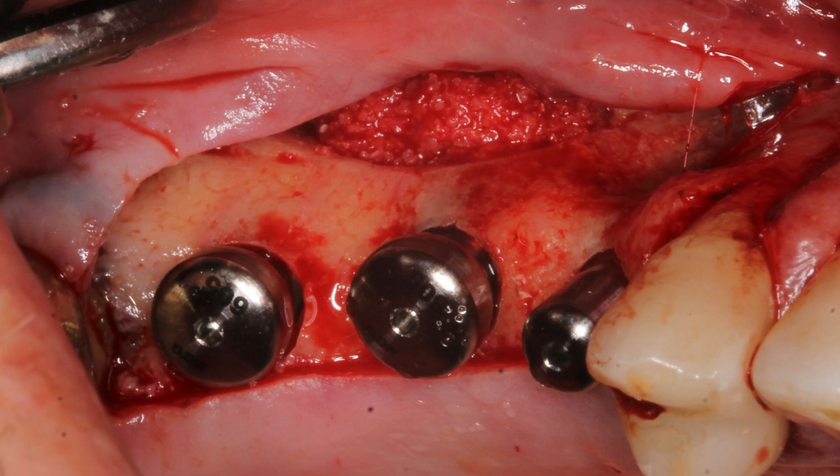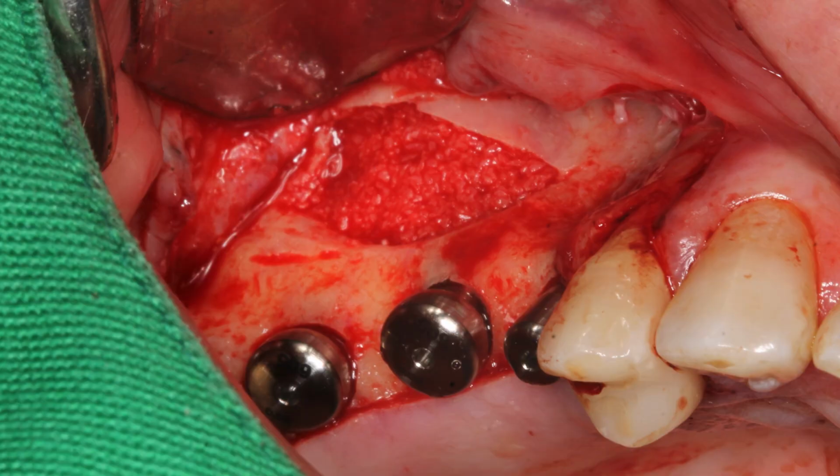The second thing is the height. You can clearly see the height of the bicuspid is much taller than the gingival margin, and the ones on the molars are slightly higher. The higher, the easier to get the good primary closure with suturing around it, but the higher the healing abutment, the higher the risk of the patient inadvertently chewing and causing micromotion, and therefore a disintegration of the implant. So that's where we have to stand, a good balance of those factors.